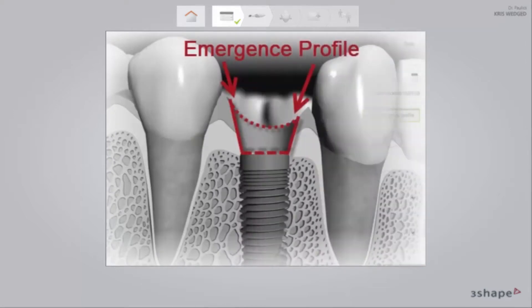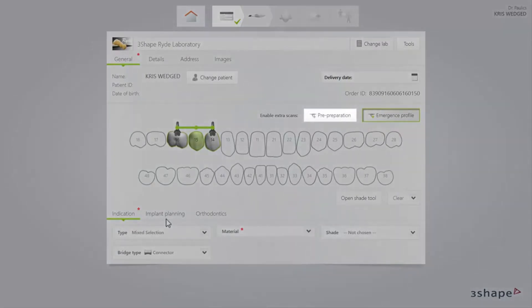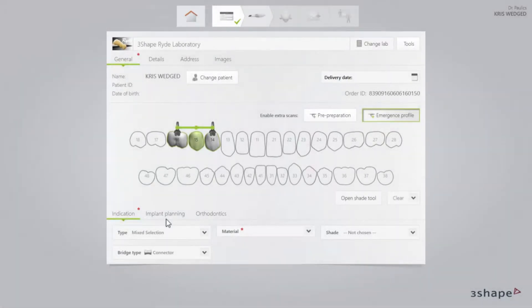When you scan implants, the emergence profile scan is selected by default. A pre-preparation scan may be added too. Finally, set the delivery date by clicking the Delivery Date button.